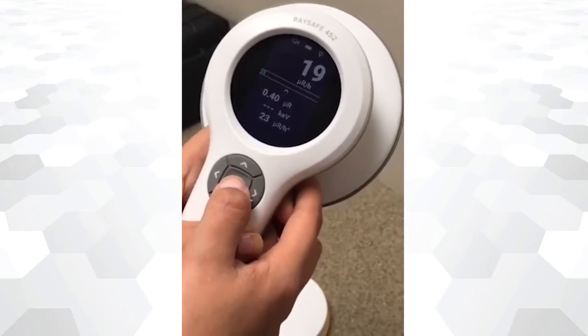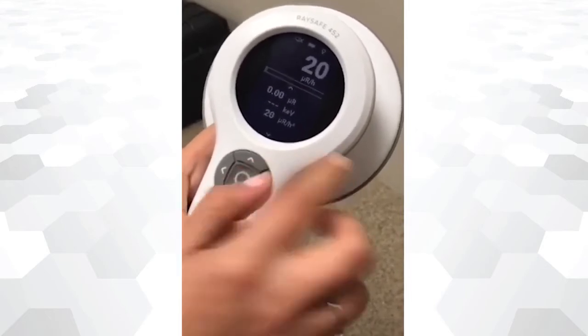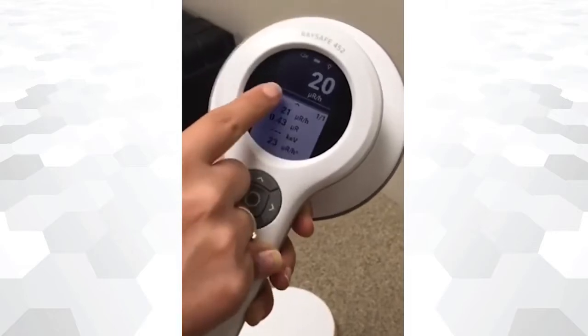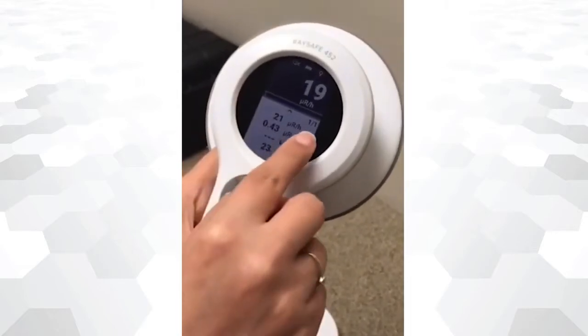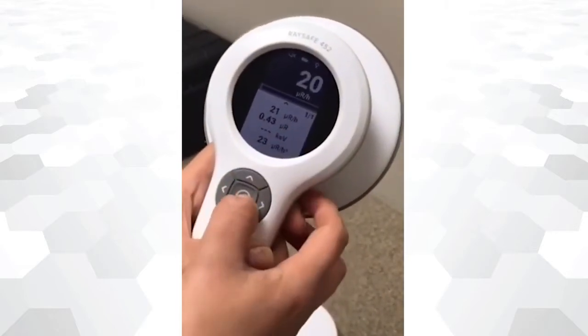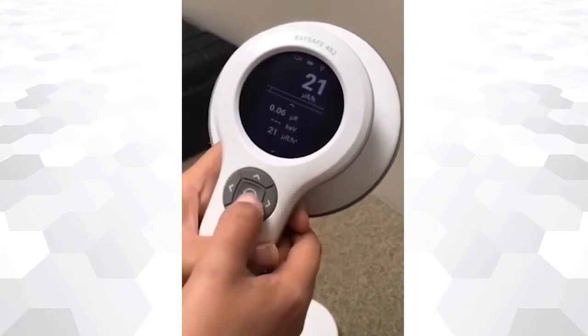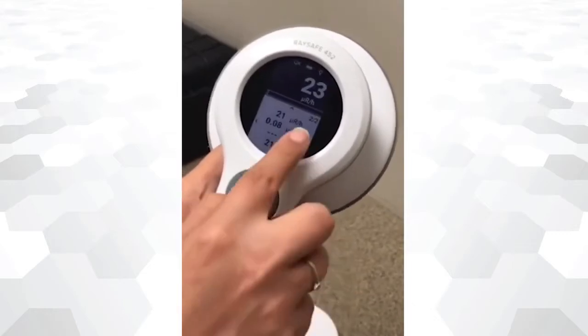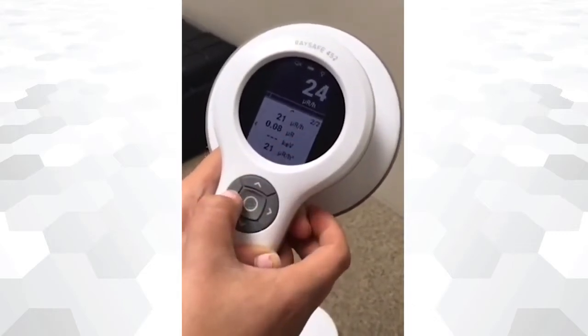To store a measurement, press the center button. The device records a log of the dose rate or count rate with a one-second resolution from power on to power off. If you want to define the beginning of a new measurement, press the center button. The readings on the screen are also stored. An arrow button will appear at the bottom to access the stored measurements while powered on.